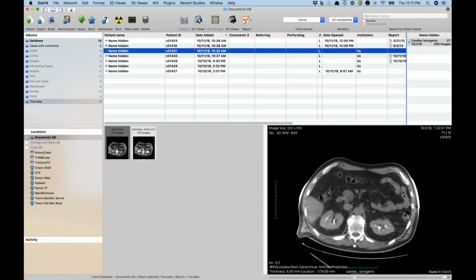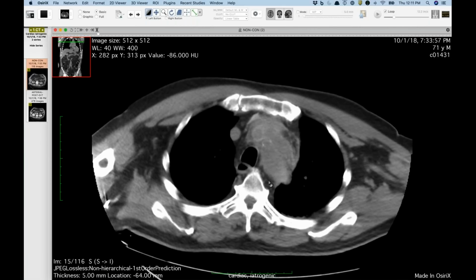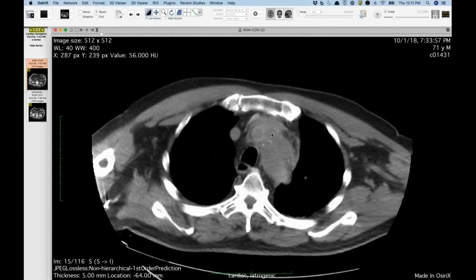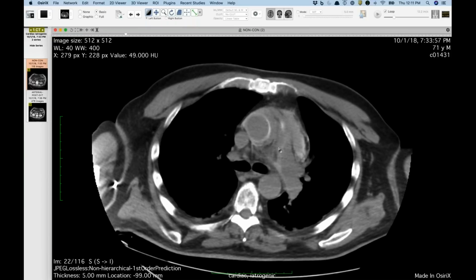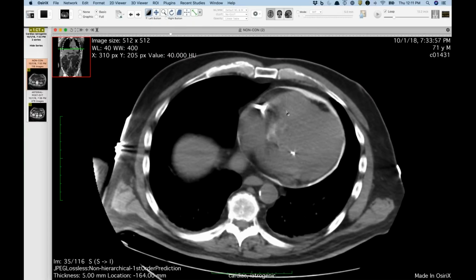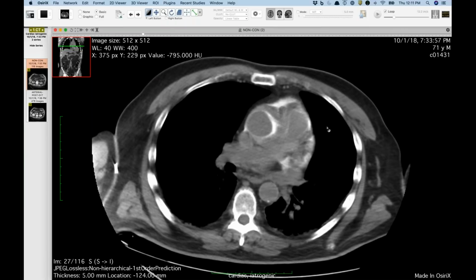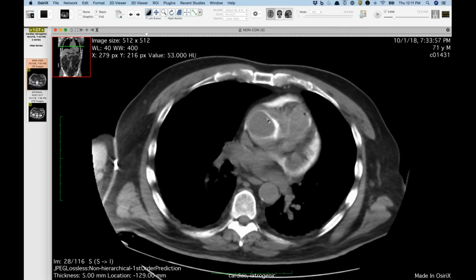This is just a quick one. This was a patient at the VA. And Howard, you'll like this one. This guy underwent a cath because he was having chest pain or something, and they had trouble engaging his right coronary artery. And this is post-cath. They know they did something, and you can see here that this is a non-contrast study, and we have a lot of iodinated contrast in the pericardial space. So they know that they punctured his RCA and injected a bunch of contrast into the pericardium.